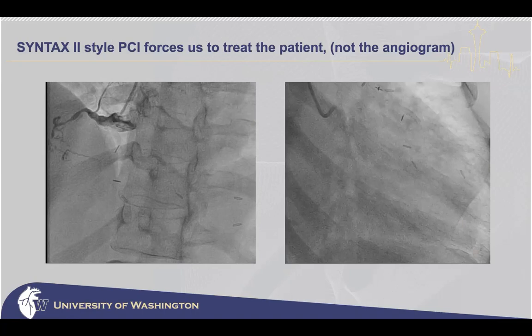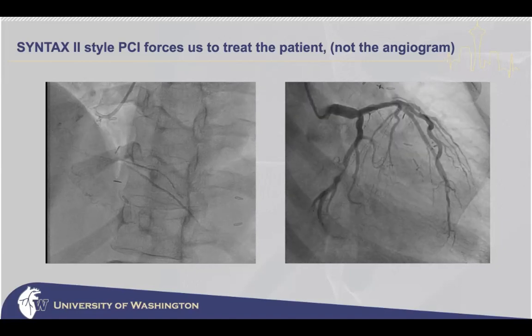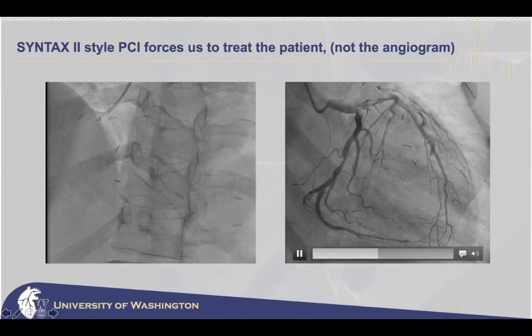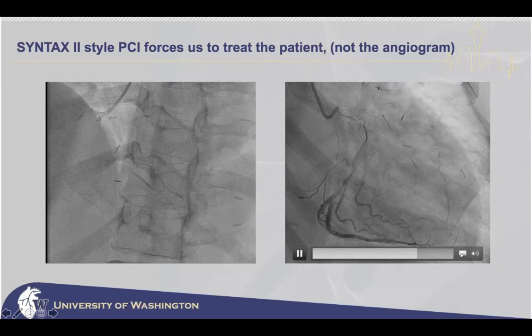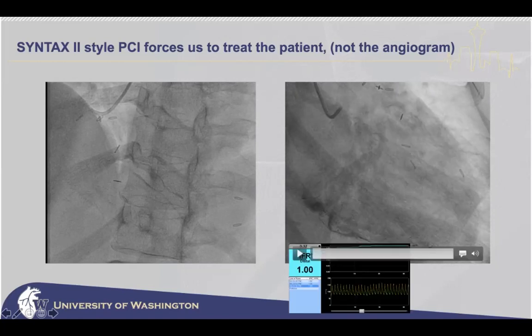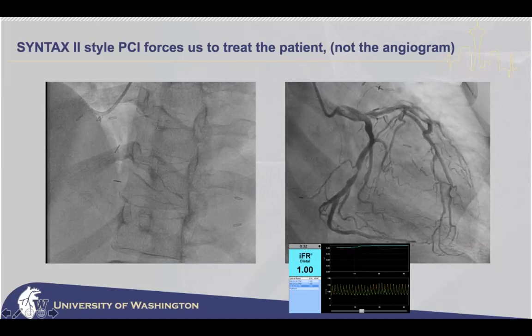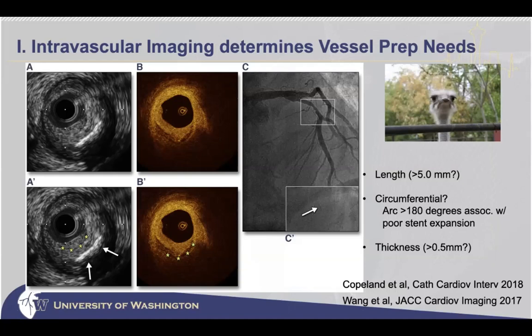Here's a case of a woman who's come back a number of times for angiogram due to angina. We've seen this occluded RCA repeatedly. We've also repeatedly assessed this circ lesion because I think that looks relatively easy to treat. I actually repeated the iFR because I didn't believe how normal it was, but again, it's 1. So by dropping a stent there, we make ourselves feel better. We don't do anything for her. She's now coming back for RCA CTO PCI after discussing that further.